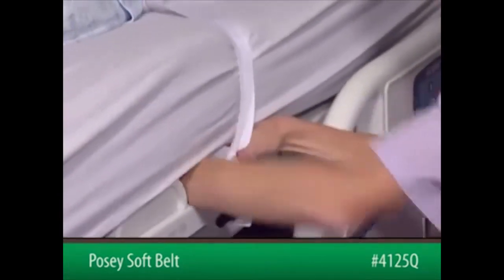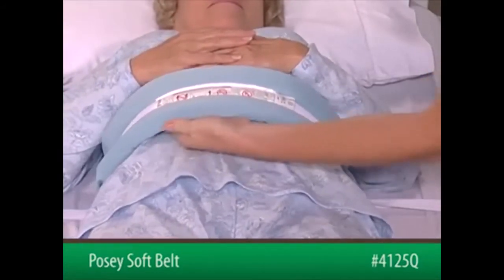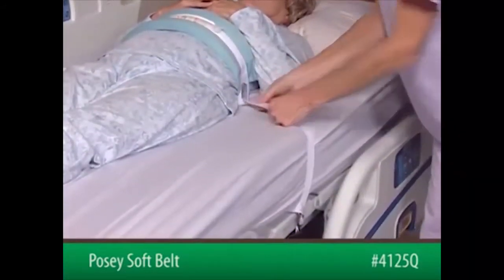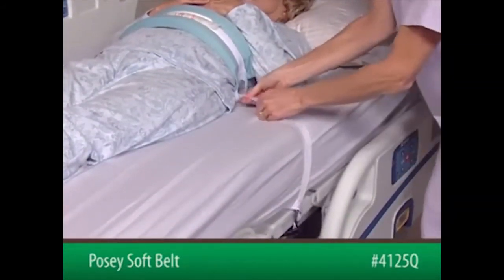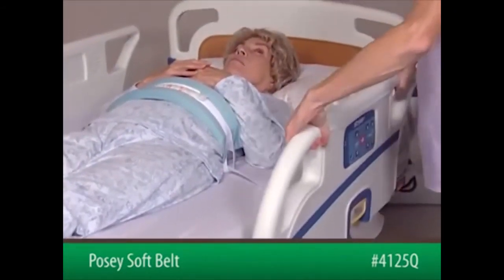After securing both sides to the bed frame, slide an open hand, flat, between the device and the patient to ensure proper fit. The belt must be snug but not interfere with breathing. Check that the straps are secure and will not change position, loosen, or tighten if the patient pulls on them or if the bed is adjusted.